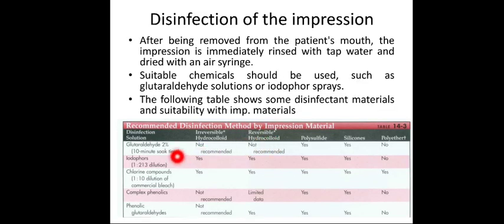Impression materials should be sterilized or disinfected by some disinfectants. This table gives the proper disinfectant that will match the impression material.